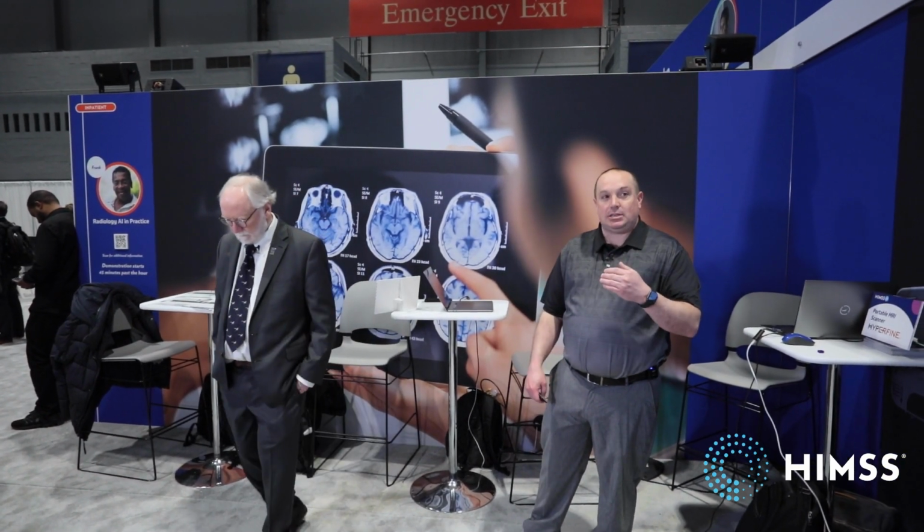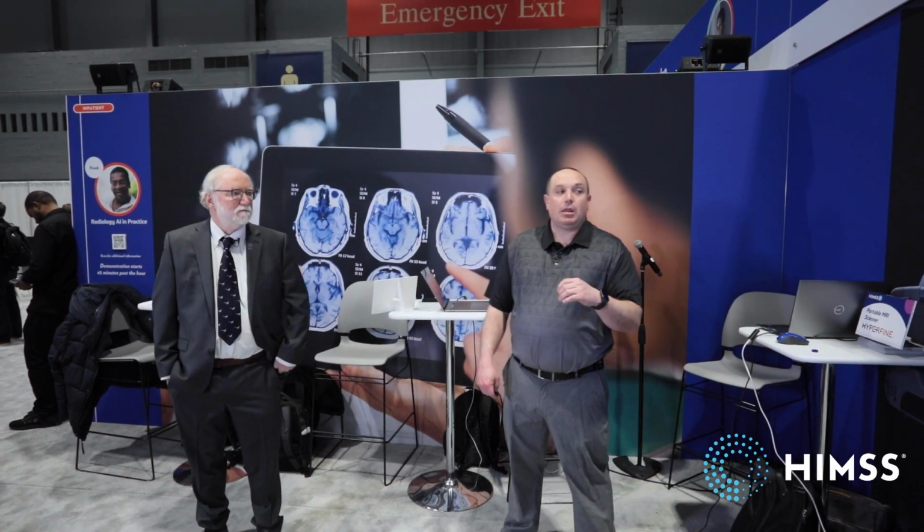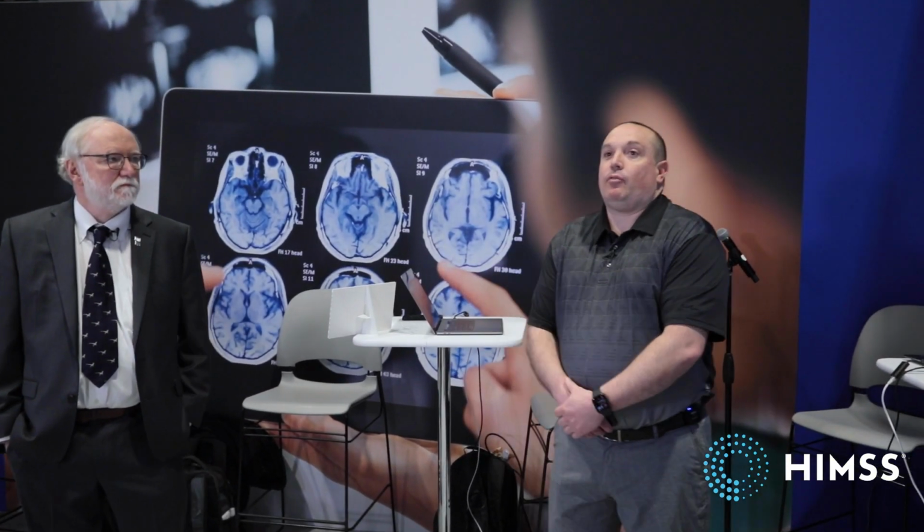I'm Brandon with Qvera, and I'm an interface engineer here for Qvera Interface Engine. As mentioned, the HL7v2 message was sent from Epic to Qvera. We then take information from that HL7 and we store that information for the modality worklist. Now, a modality or imaging machine, you cannot push data to it. What you end up doing is it queries, so you have to store that data. So we store that data.